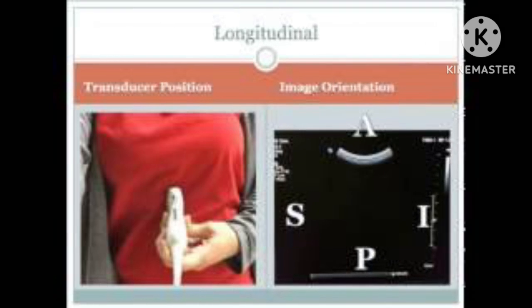In this slide, the probe is placed in a longitudinal section as the indicator is facing towards the patient's head. And on the image, this side should be the anterior side, this side should be the posterior side, this side should be the superior side, and this side should be the inferior side. Remember, on a longitudinal section, the anterior side, posterior side, superior side and inferior side of an organ are visible.